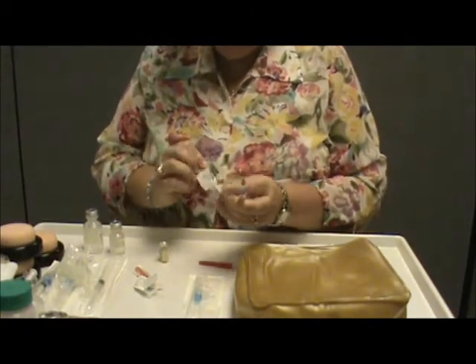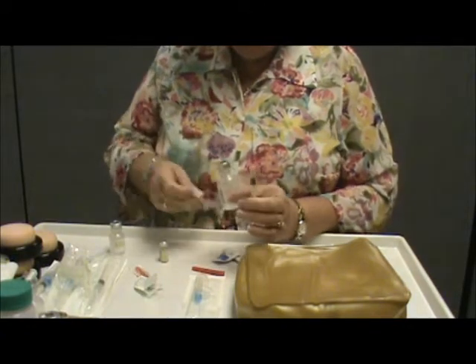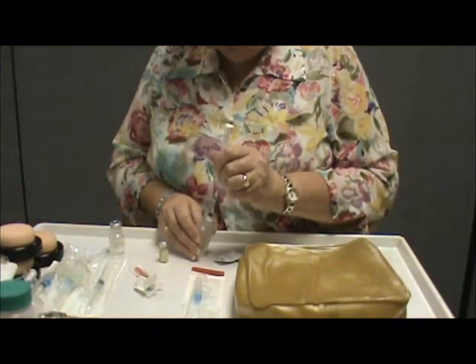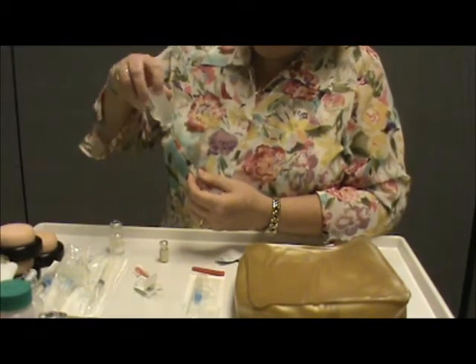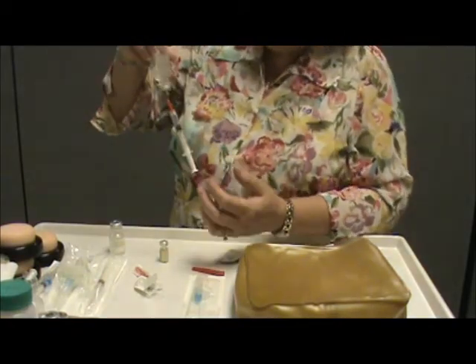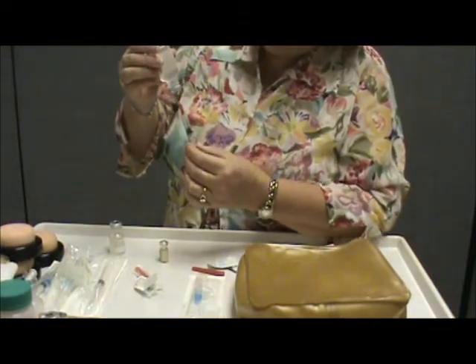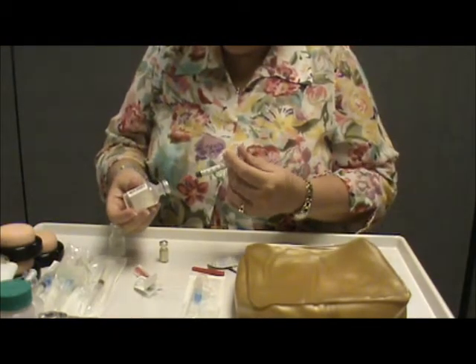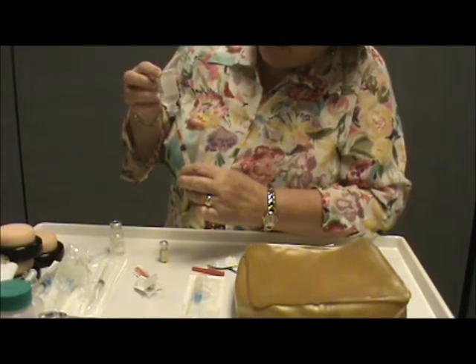I am going to cleanse the top of my vial, allow it to air dry, access my vial. You want to go right into the center, and then when you turn it upside down, you want to be able to see the fluid level. You want to make sure that your needle is well below the fluid level so that you're not drawing air. I'm going to turn it back over, inject, and withdraw my fluid.